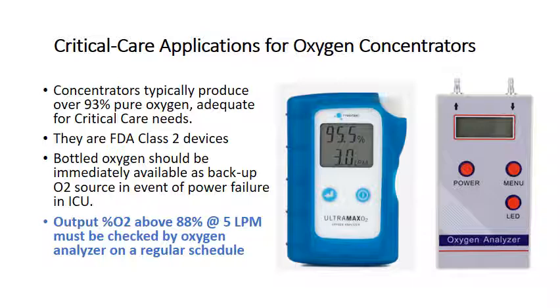You also need to check them on a regular basis to ensure that they have at least 88% pure oxygen content.